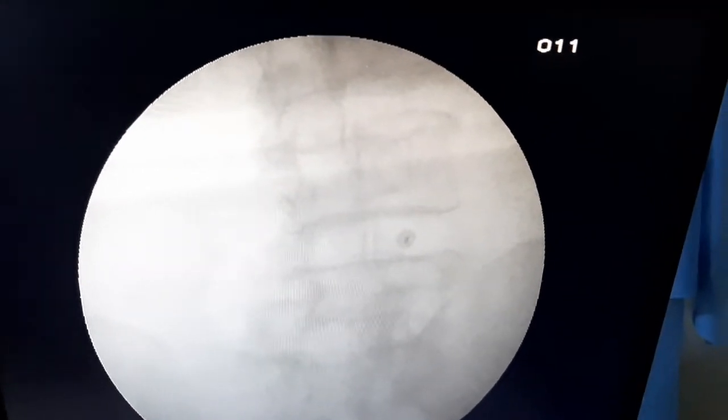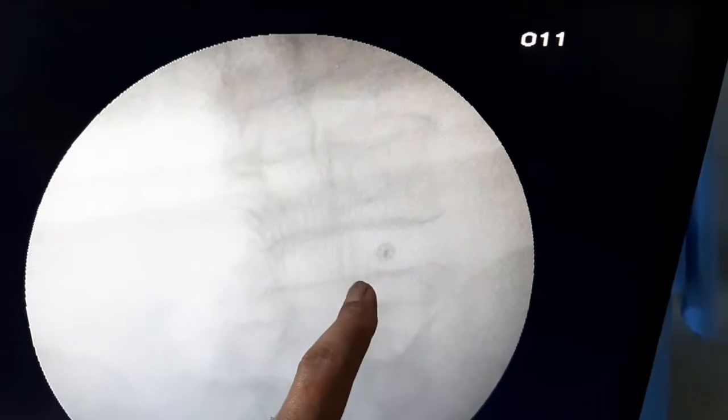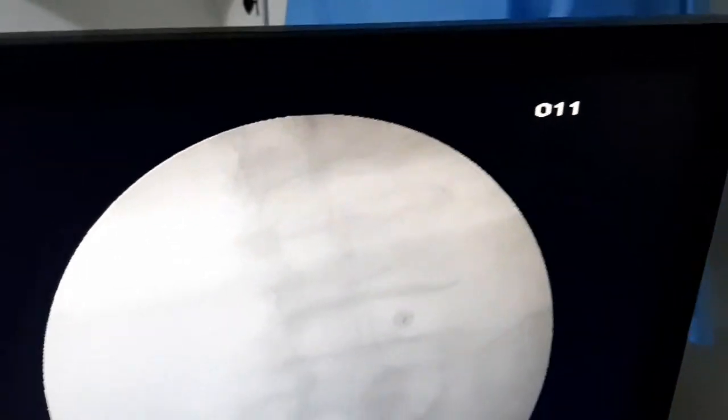I started the procedure. I am going to proceed with the intra-discal needle. You are seeing the intra-discal needle. This is the AP view — you are seeing the needle in the center of the disc.